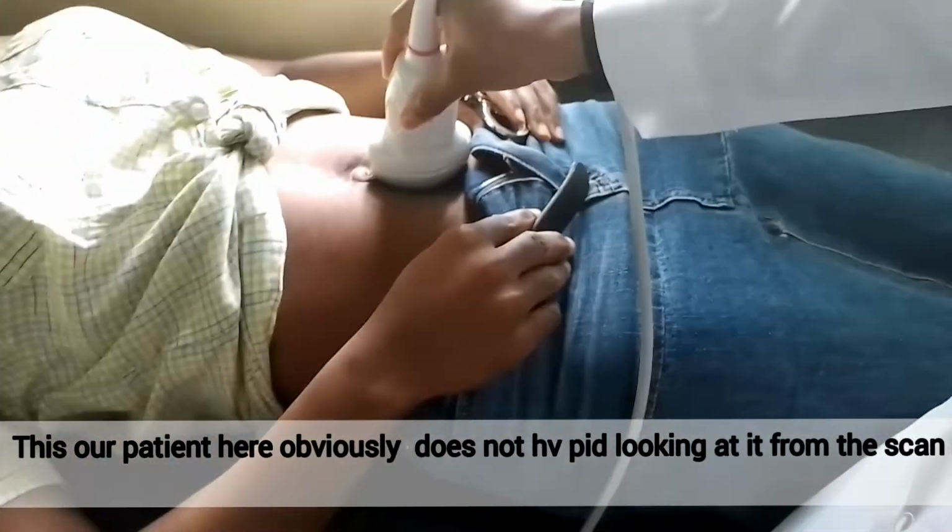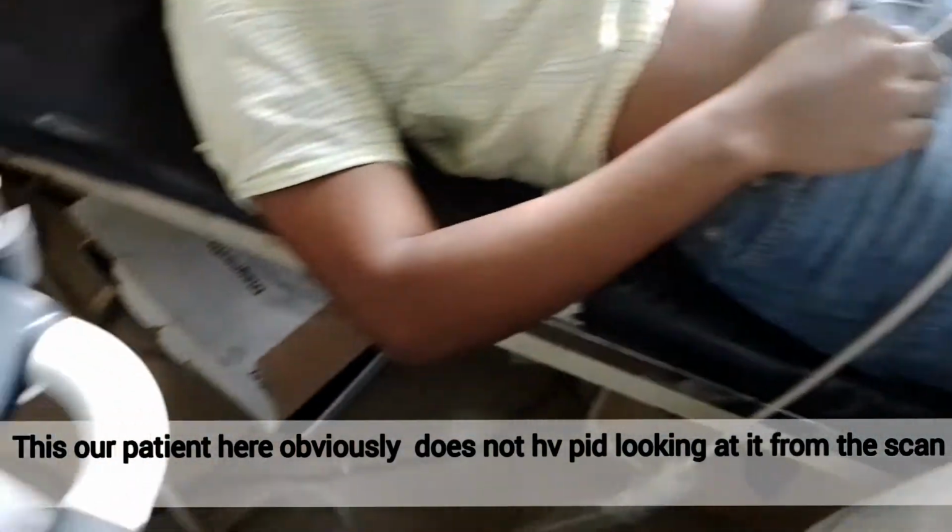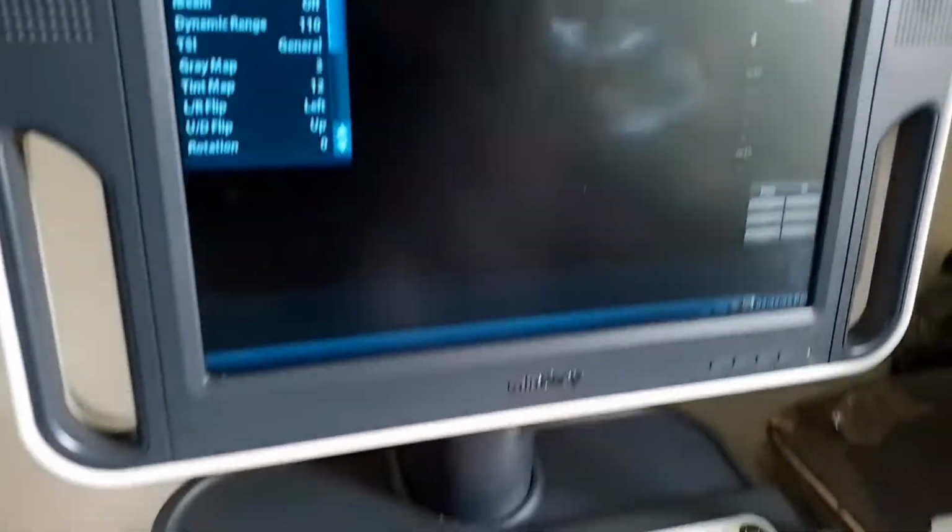Our patient here obviously does not have PID, looking at it from the scan.